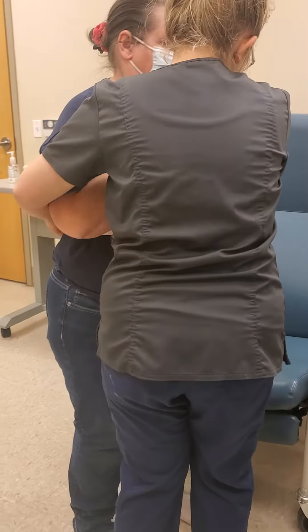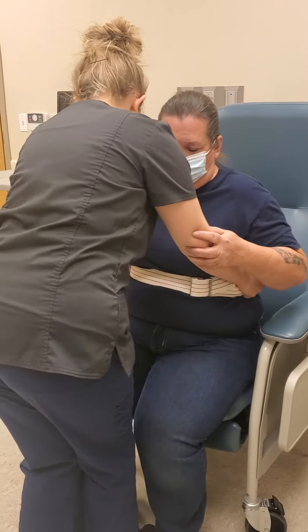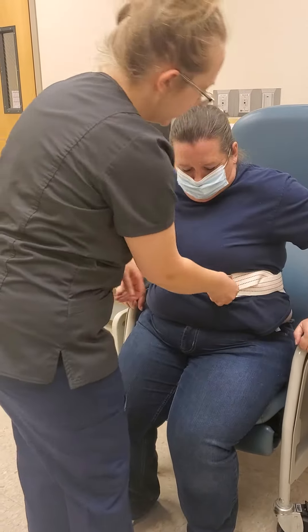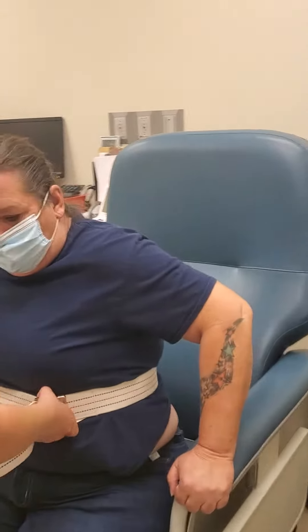I'm going to put my hands back on your side underneath the belt. And just sit down. Are you feeling comfortable? Yes. Since my patient is feeling comfortable, I'm going to remove the gait belt.